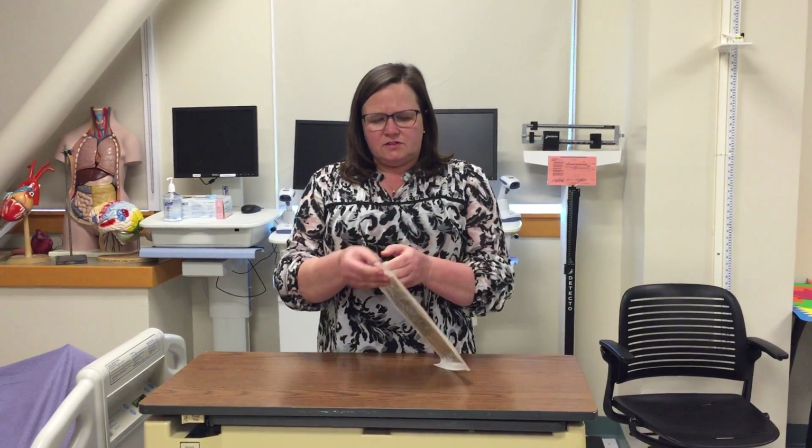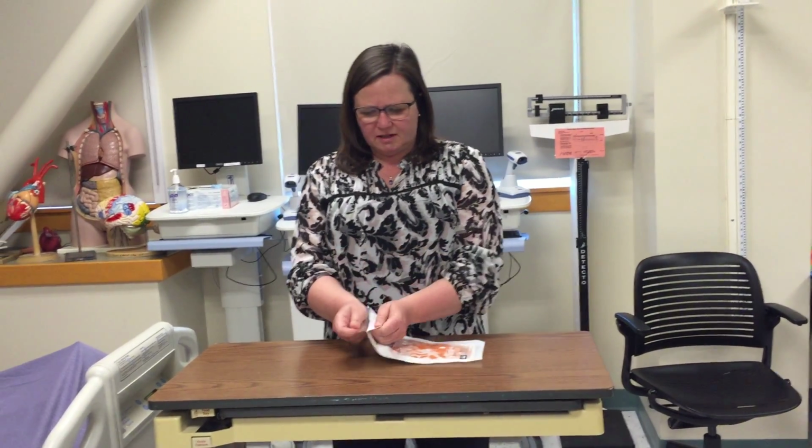Right, we're going to talk about how to put on sterile gloves. Later on, you're going to have a student demonstration of putting on sterile gloves as part of the dry sterile dressing. So you're going to have started with clean hands. I've already washed my hands and dried my hands using the proper technique, and now I'm ready to put on my gloves.